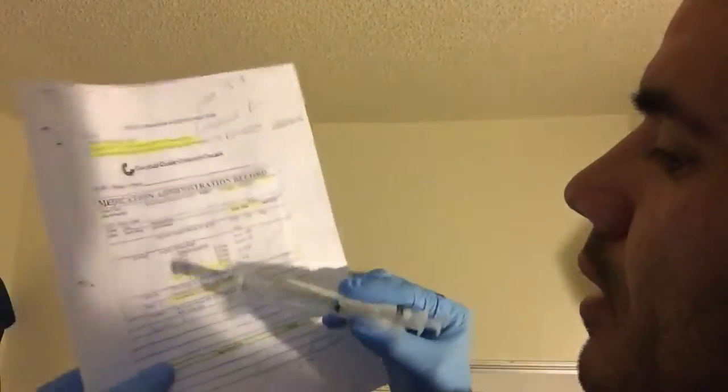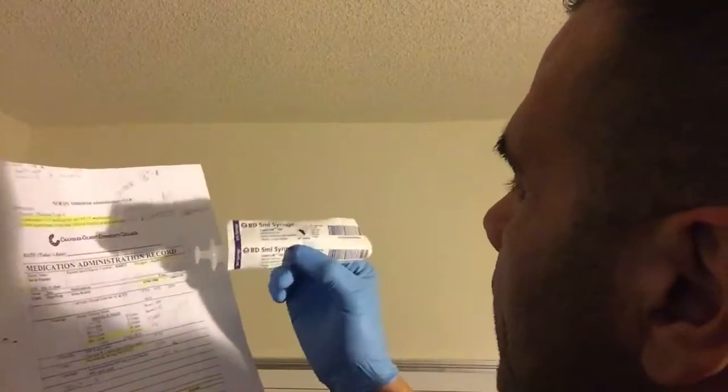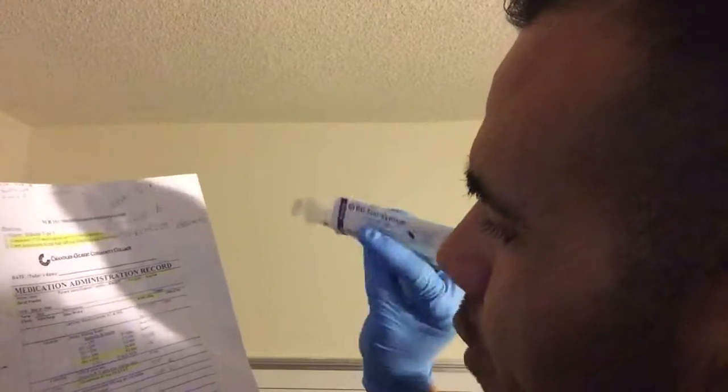So again, I'm going to go back to my MAR. Furosemide says it's intramuscular. So I'm going to look at my MAR, and it says furosemide 40 milligrams. And I'm going to look at the medication that I prepared. And I wrote on there, I labeled it already. It says 40 milligrams furosemide. So I've double checked. This is furosemide. I have 40 milligrams, and then my MAR says I need 40 milligrams furosemide. So I've double checked, verified that's correct. And I also have about 1 milliliter worth of volume inside my syringe.